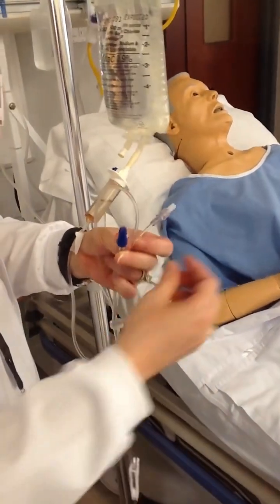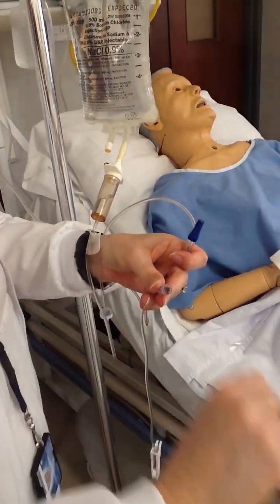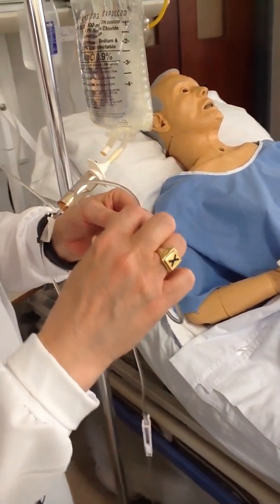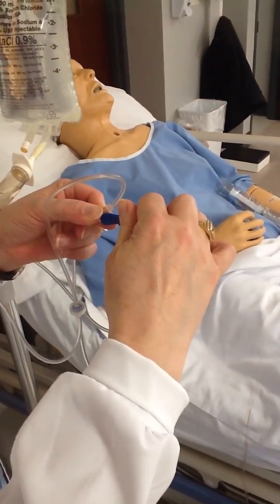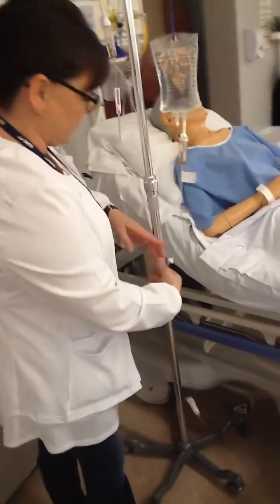Okay. And then I'm going to carefully remove that sterile cap. And this is a push and twist. That's a positive pressure valve there. We're going to push and twist. Okay. Each time we connect and disconnect that deserves a very good scrubbing before it's reconnected. That's how we protect our patient.